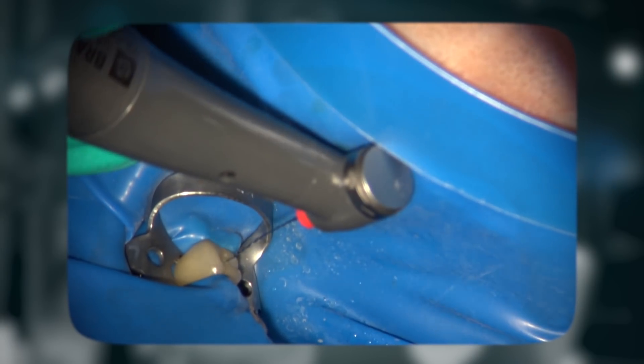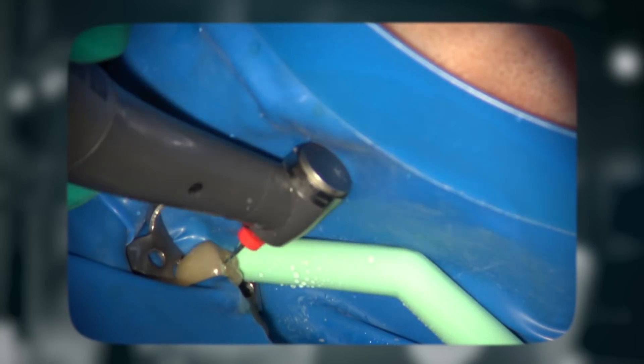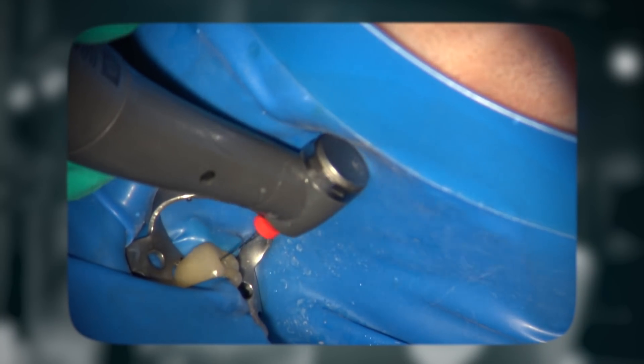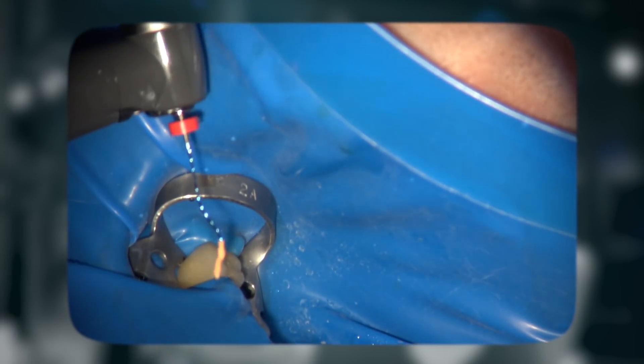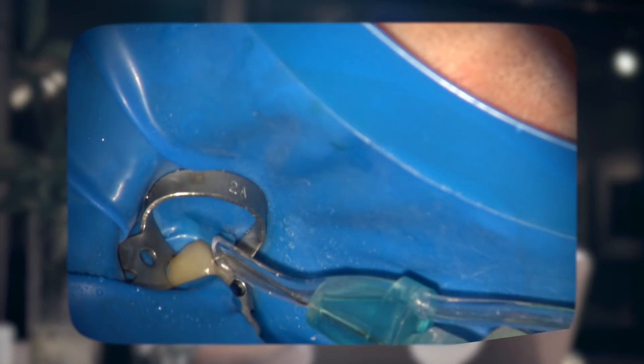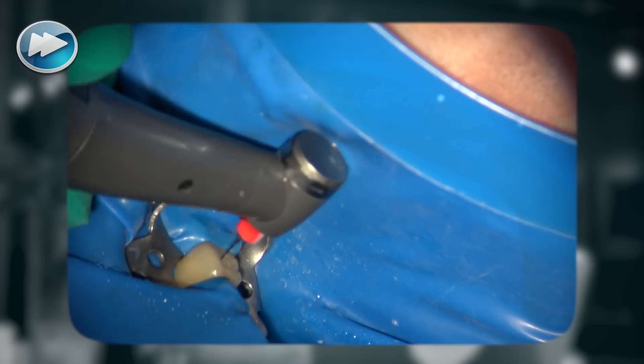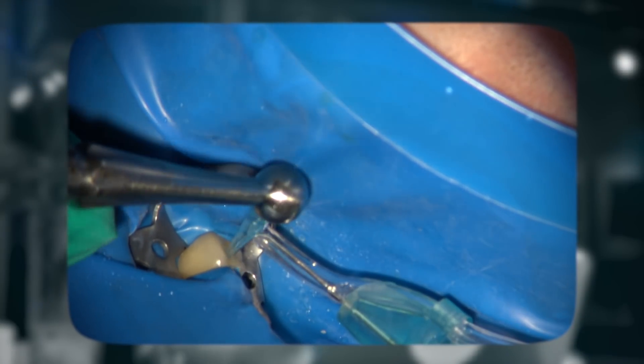After using the 3D finisher with sodium hypochlorite, the remaining gutta-percha on the wall was easily removed and stuck to the tip of this instrument. The 3D shaper will adapt to the canal walls and remove dentin anatomically. Three cycles of 20 seconds each, alternating between sodium hypochlorite and EDTA, can help finish the anatomical shaping in these types of cases.